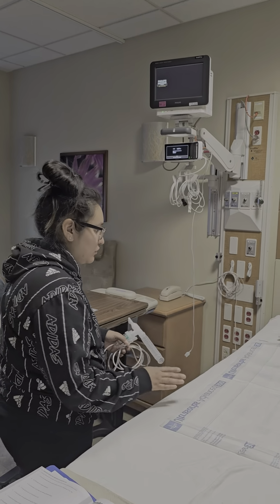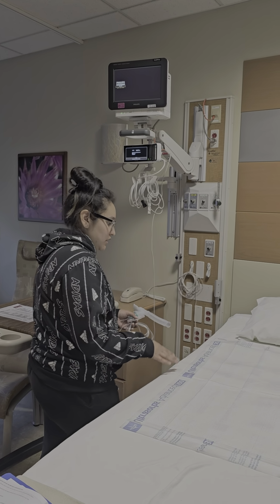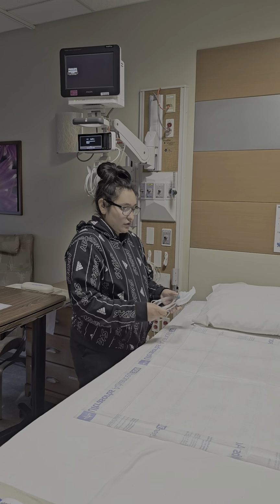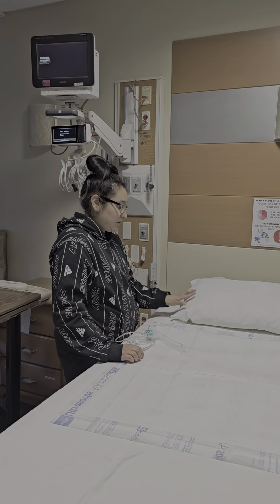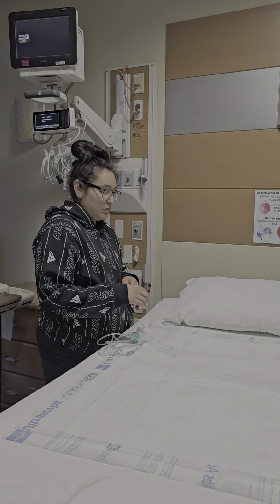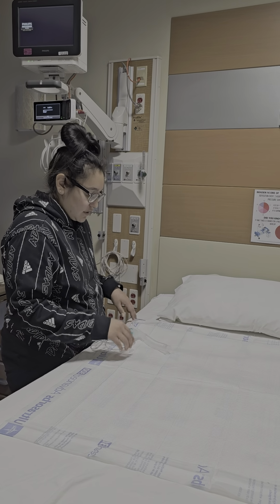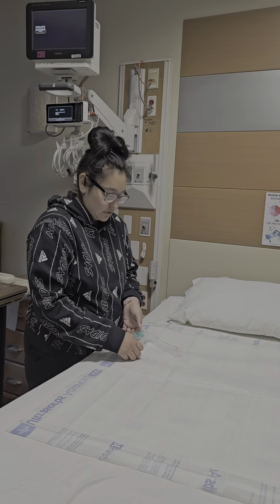When you walk into the room, you want to introduce yourself, verify it's the correct patient, let them know what you're doing. In this case, we're doing a small volume nebulizer treatment. Before you do anything, you want to assess the patient. You want to wash your hands, put on the correct PPE, assess the patient. You'll do vital signs, check for SpO2, check for breath sounds. Put the patient in a comfortable position. It's mostly they'll be sitting up.